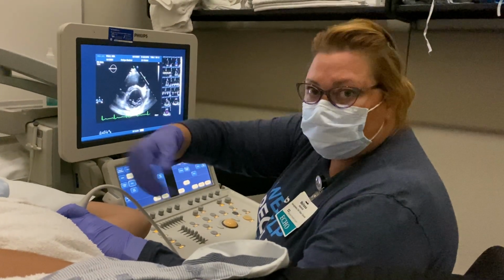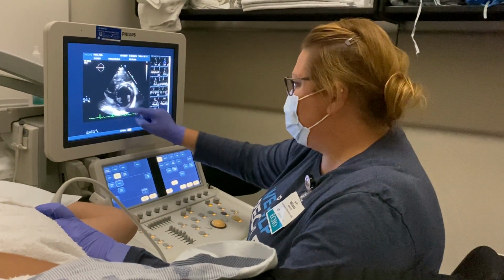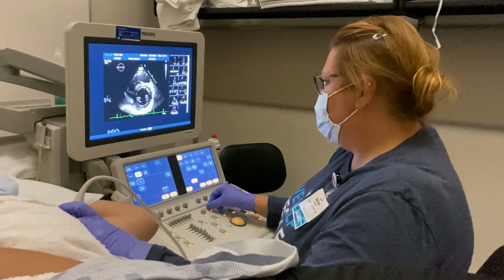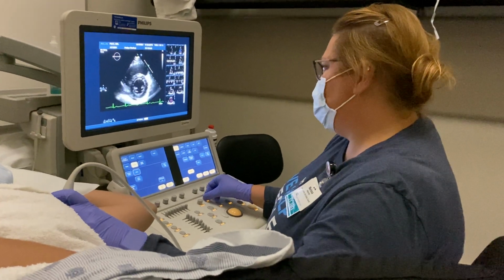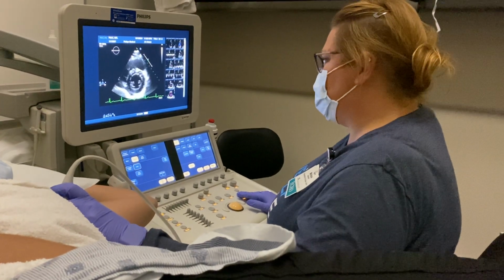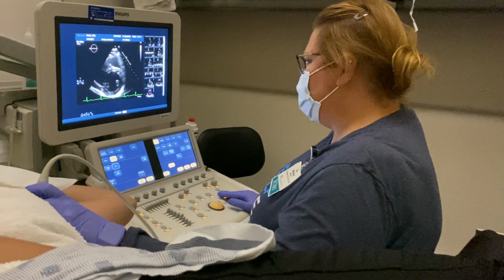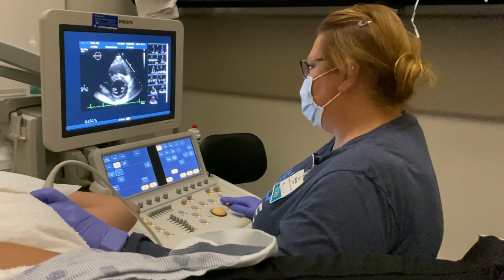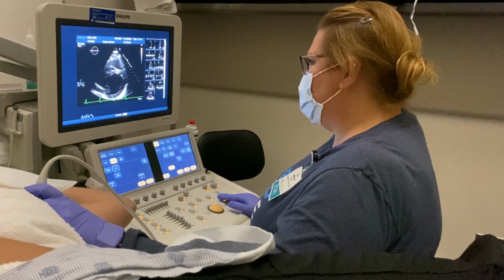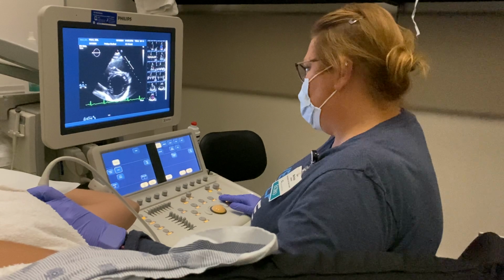Now I'm going to tilt further towards her hip. Notice how my right ventricle is still in the view. That's just as important as the left. Moving towards her sternum to make things more circular. I move up a rib space. That's even a little better. And again, the reason why we want to look at this view here is because we can see all three coronary arteries and how they feed those segments. Six segments, yep. Got a moment.